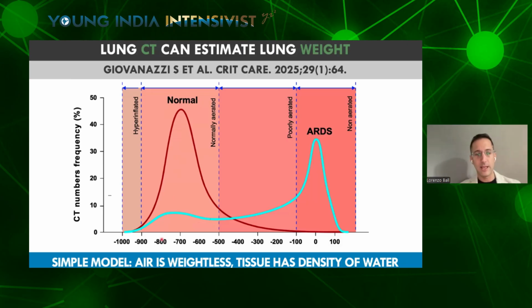More or less, the density is 0.2 grams per milliliter in a healthy subject, so 1/5 of the weight of water. In the collapsed areas in ARDS, or even in atelectasis, if we think about a milder disease like the atelectasis that we see in postoperative patients, the density is 1, which is the density of water, 1 gram per milliliter.